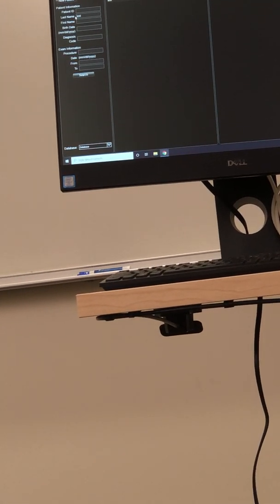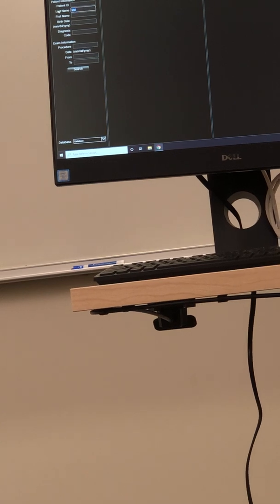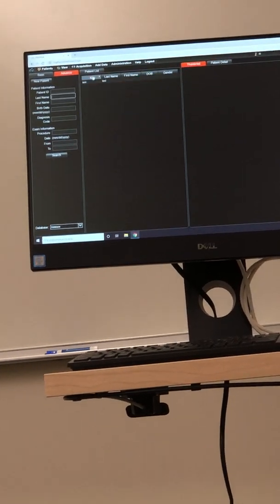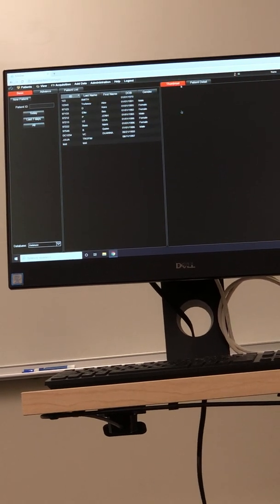Okay, now let's go back to patient list, and I'll bring up everybody here. I'm going to show you what images we have in there first.